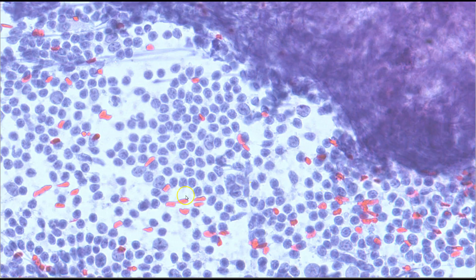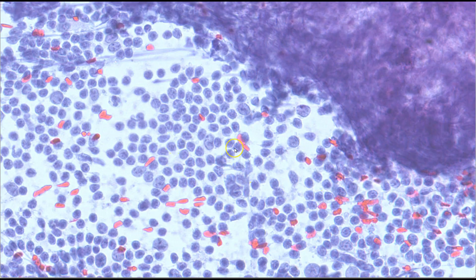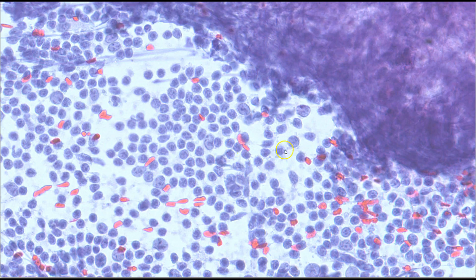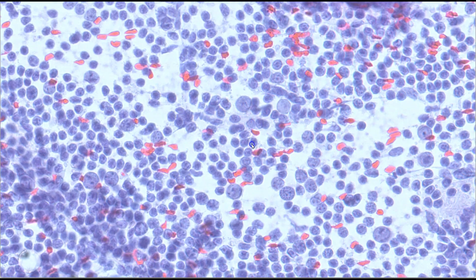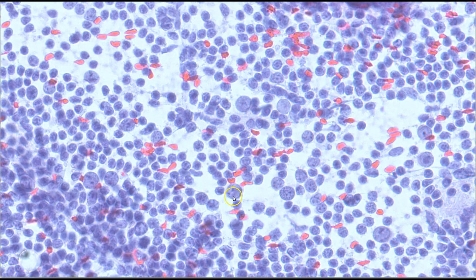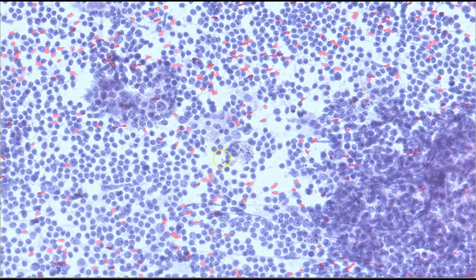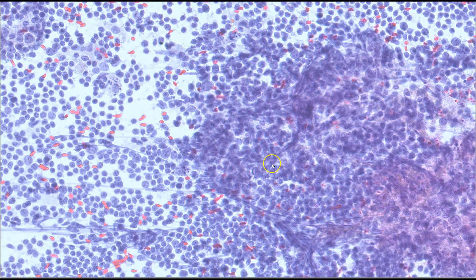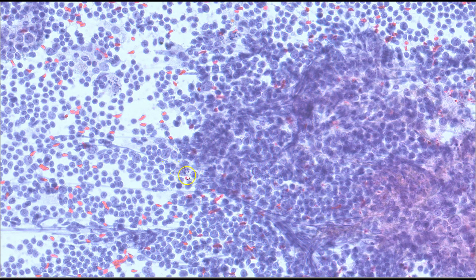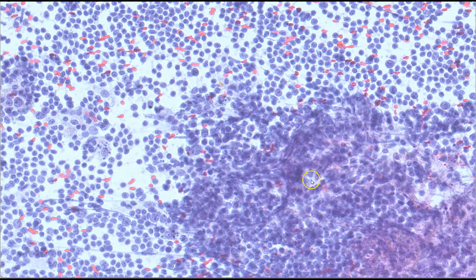Again, we can see that the population of lymphocytes is predominantly small, with occasional medium-sized cells, and then scattered larger, more activated lymphoid cells. In this area we can see a tingible body macrophage. And as we move to this aggregate here, again we can see a few scattered tingible body macrophages.